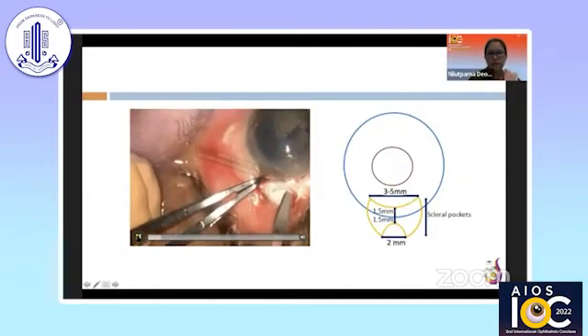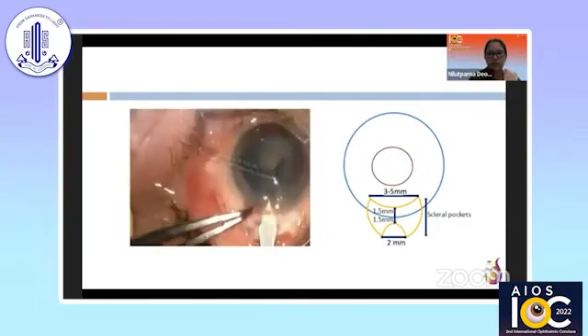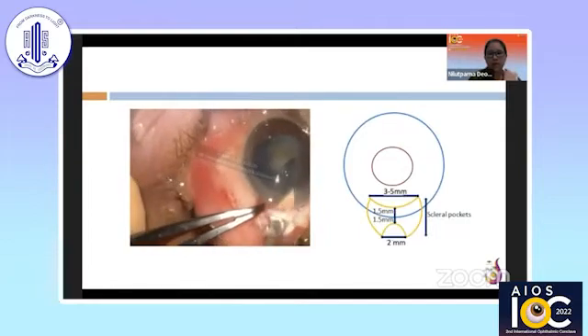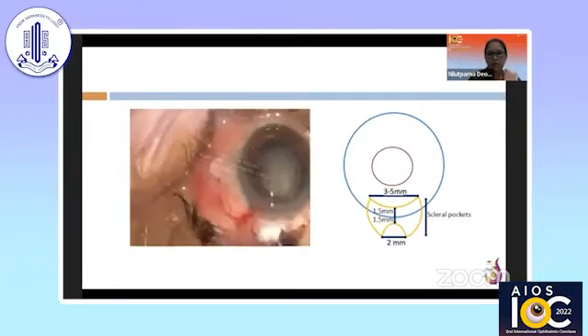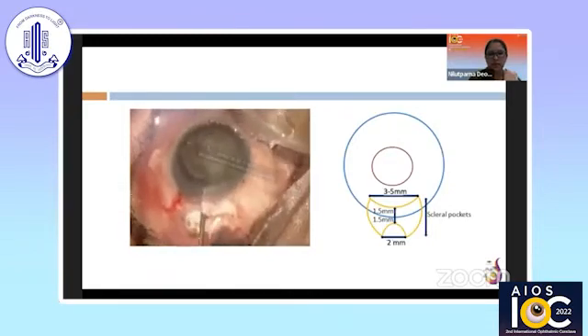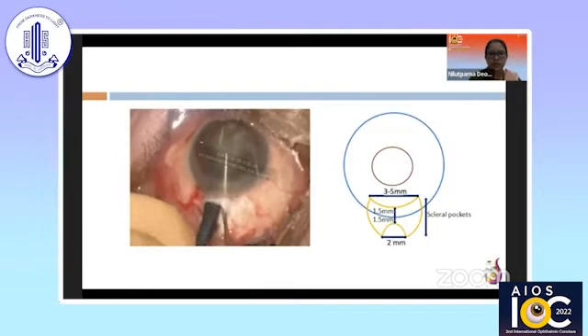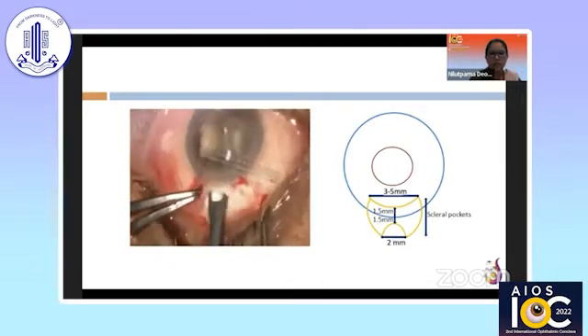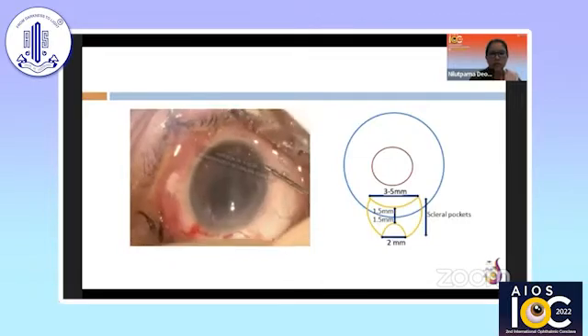After creation of the scleral pocket, we entered the AC with the keratome, but I had not made any initial back cuts in this video. After prolapsing the nucleus, it was held steady with the left hand using the vectis, and as we continuously put in the visco and brought in the fragmented nucleus, you can observe there was a purse-string effect. This purse-string effect occurred because I did not give the back cut initially — I had thought it was only needed when implanting the PMMA IOL.